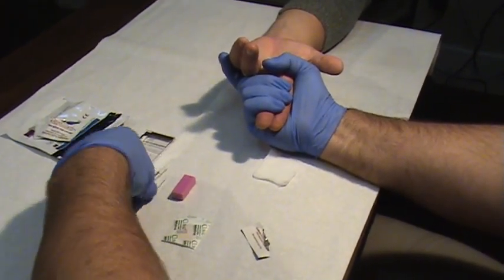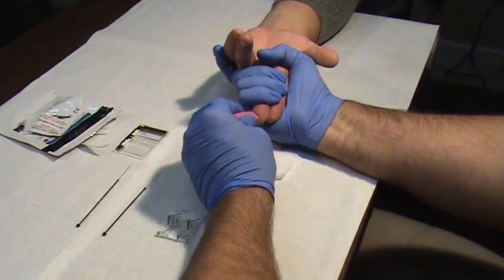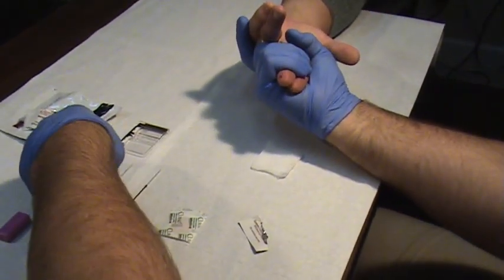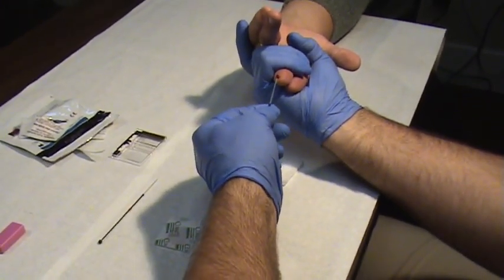So I squeeze it again, I'm ready with my lancets, and I push it firmly. And I allow blood to flow a little bit before I start to use the sample.